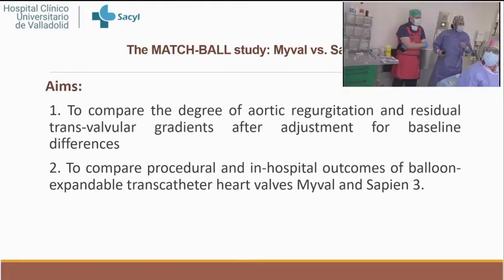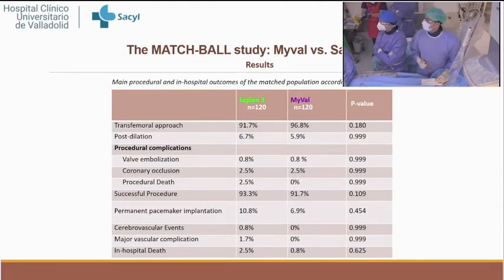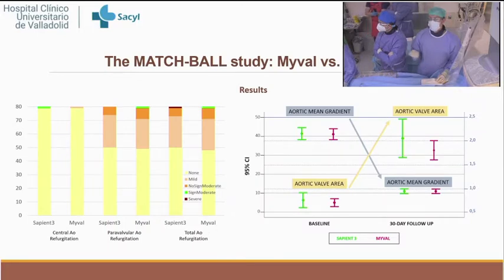Thank you. So very quickly, I'm going to talk also about the Myval study, a retrospective matched study, and I think this is the first comparison with SAPIEN 3 valves. Next slide. We did the matching for degree of calcification, annulus size, and left ventricular ejection fraction, and we found similar procedural results, similar rates of vascular complications, cerebrovascular disease, and in-hospital death. Actually, before matching, there was a lower rate of pacemaker with Myval, 7 versus 14%, but after matching, two groups of 120 patients, there are no longer significant differences, although it's lower with Myval. Next slide. And no differences in the degree of aortic regurgitation or in the gradients and valve area.